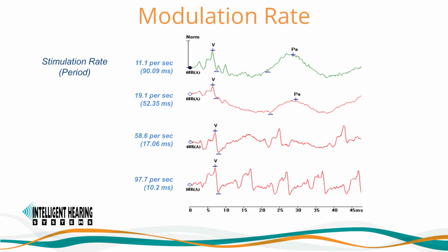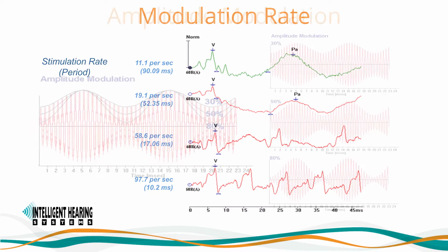It is important to also keep in mind that MLR components are also affected by the maturation of the auditory system. Fast modulation rates between 70 Hz and 110 Hz elicit the ABR components and result in lower amplitude recordings. But like the ABR, these responses are not dependent on patient state, making these the preferred range of modulation rates used in the SmartEP-ASSR software.